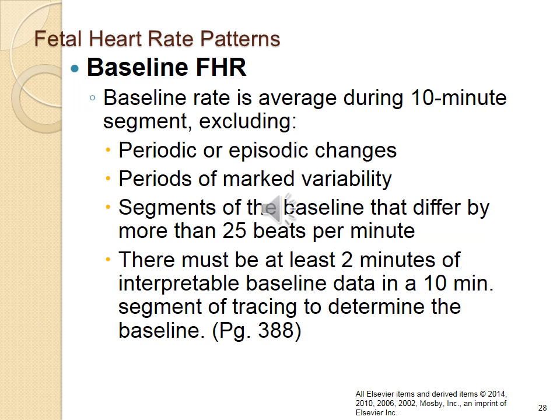Baseline fetal heart rate is averaged during 10-minute segments, excluding periodic or episodic changes, periods of marked variability, and segments of the baseline that differ by more than 25 beats per minute. There must be at least 2 minutes of interpretable baseline data in a 10-minute segment of tracing to determine the baseline. Page 388 in your textbook.